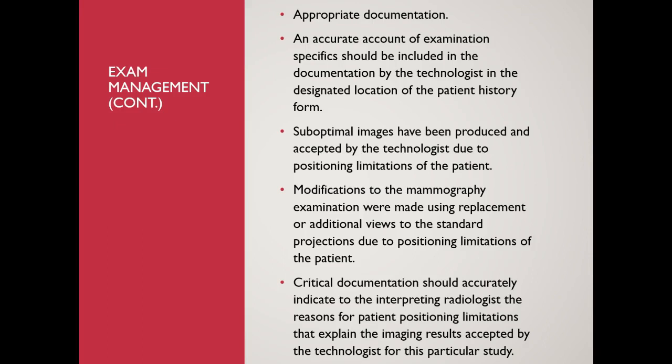Critical documentation should accurately indicate to the radiologist the reasons for the patient positioning limitations that explain the imaging results accepted by the technologist for this particular study. So when you finally have everything that you're going to accept, make sure that the radiologist knows what your limitations were.